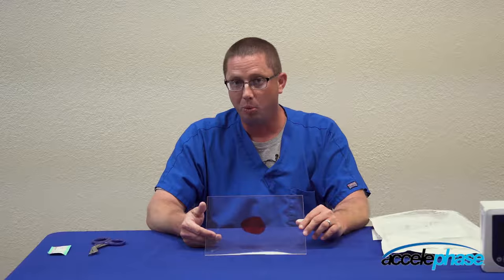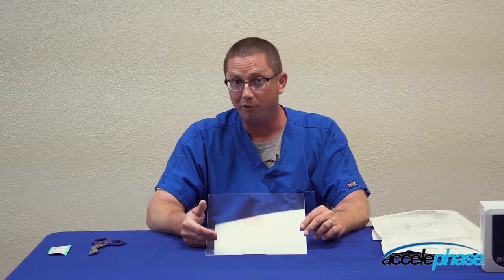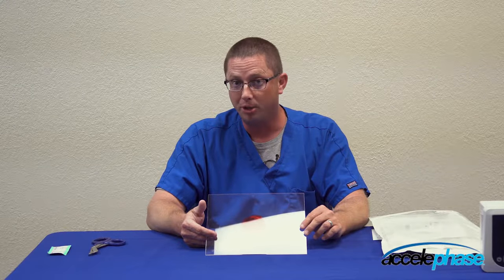In this video, I'm going to instruct you on how to apply a negative pressure wound therapy dressing. We are going to be using a foam-based dressing with your traditional drape application over the top.